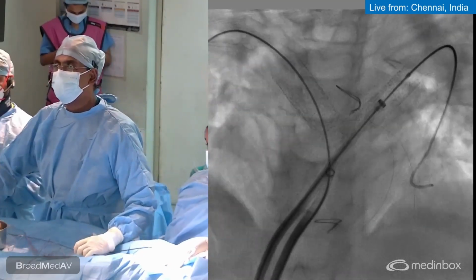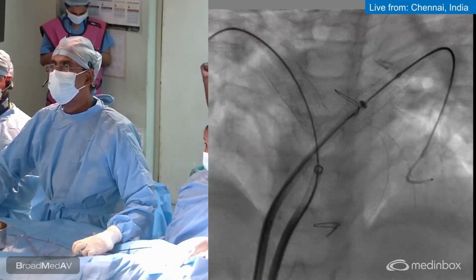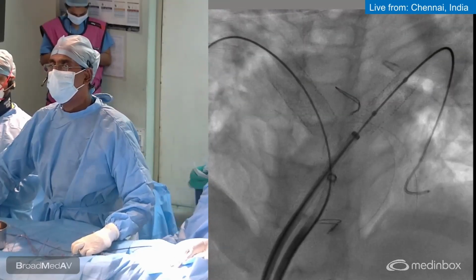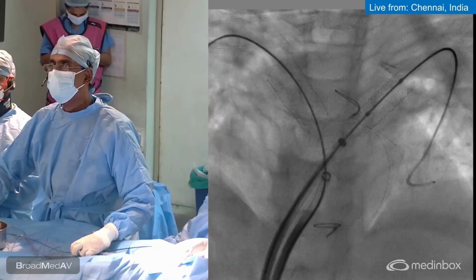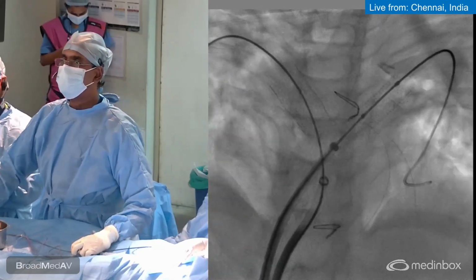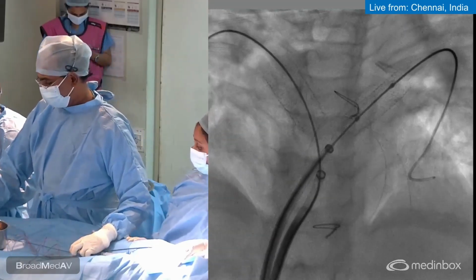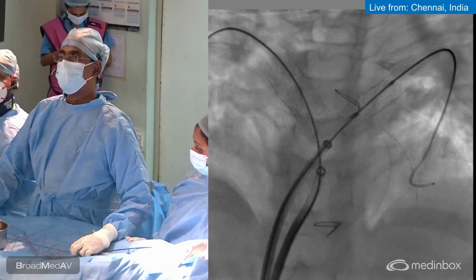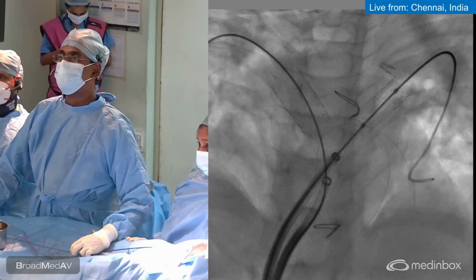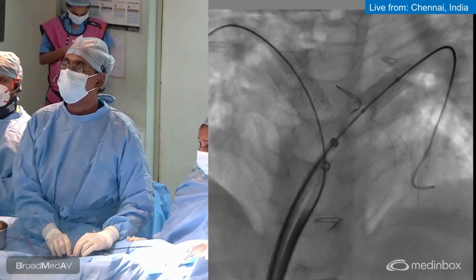Yeah. No, take away the negative. There is no need for negative. Yes. Okay, slowly keep inflating. As soon as you grip the stent, yes. I'm going to slightly drag it down. That's it. That's it.